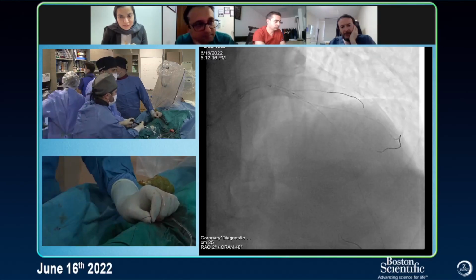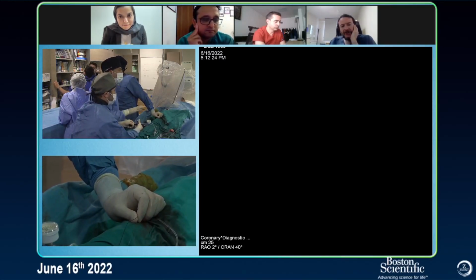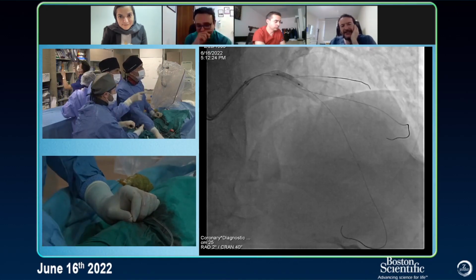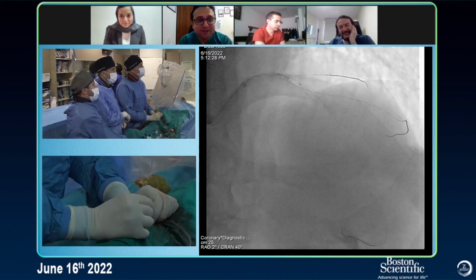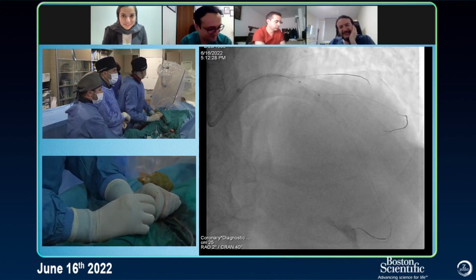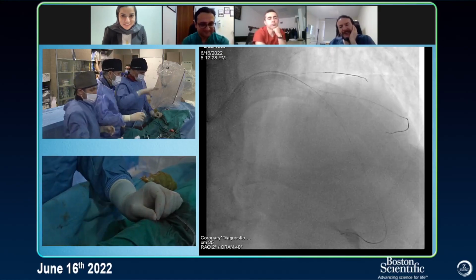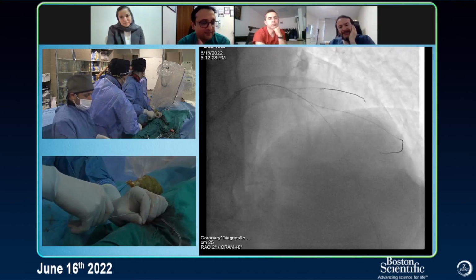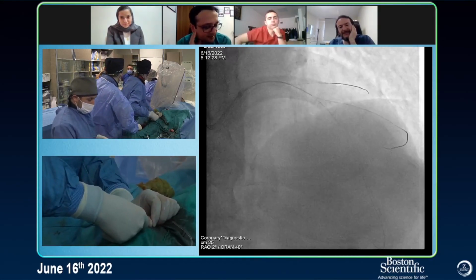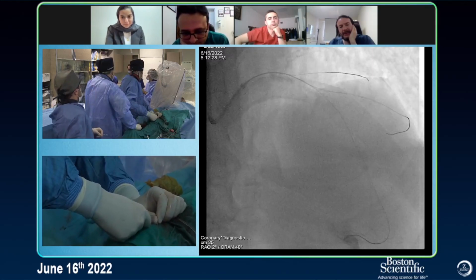Proximal opening is good. First NC, now cutting balloon. Cutting or scoring. This is a Boston session, so we are going to do a Wolverine, I think. Which scoring balloons? Six is okay.